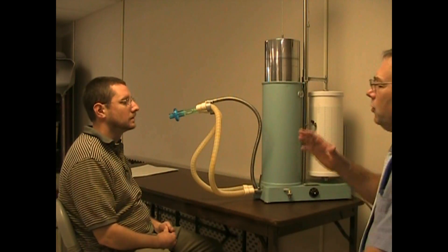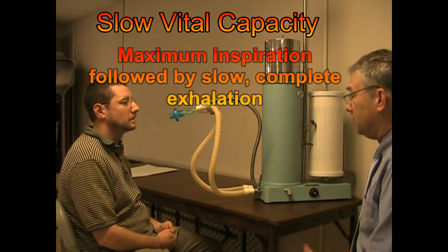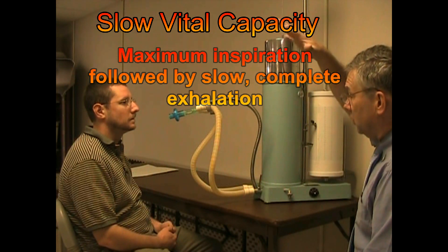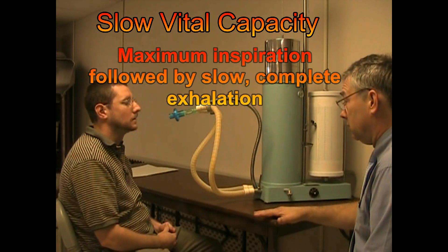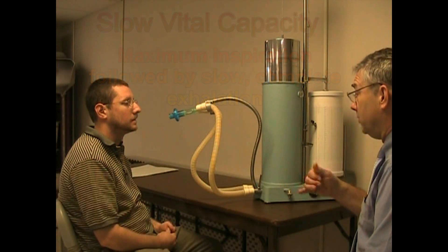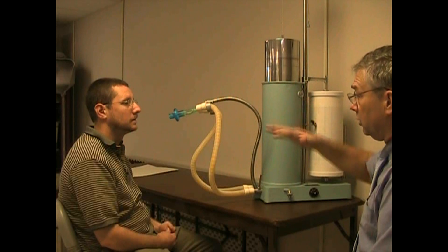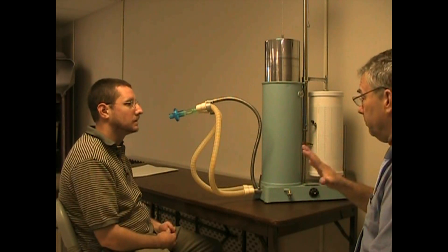This time what we're going to do will be a maximum breath — a slow, sustained breath. What you're going to do is take in a great big deep breath in, and then just ease it all the way out until you can't get anything out. Start with normal, easy breathing, then I'll tell you: big breath in, fill it up, then blow it out at medium speed. Not real slow, but medium.